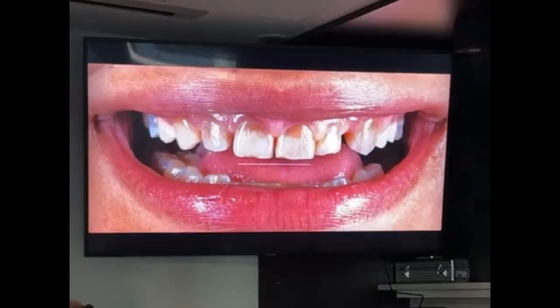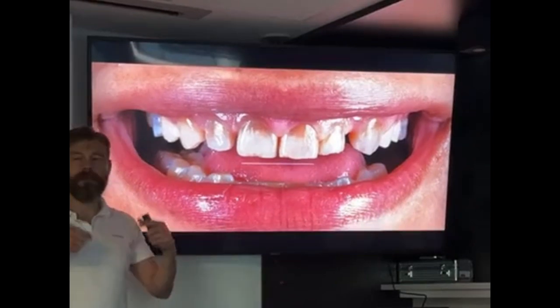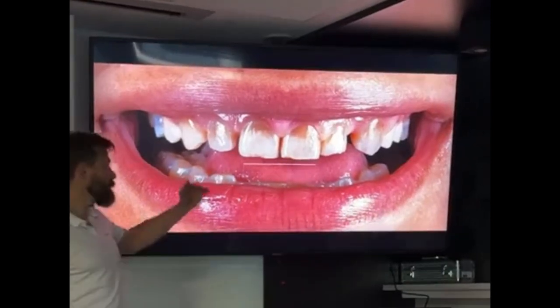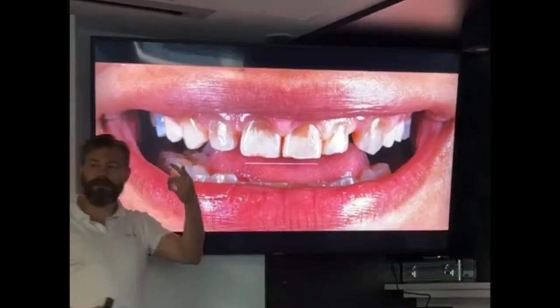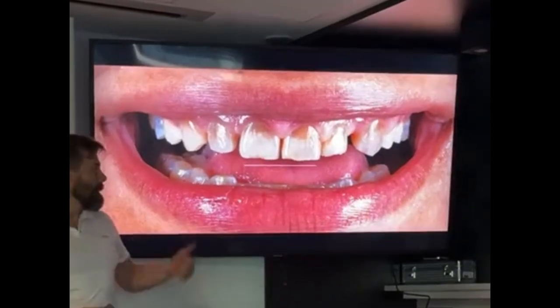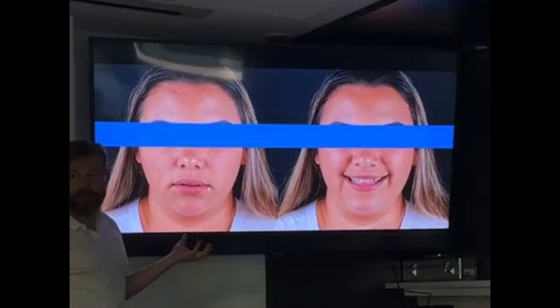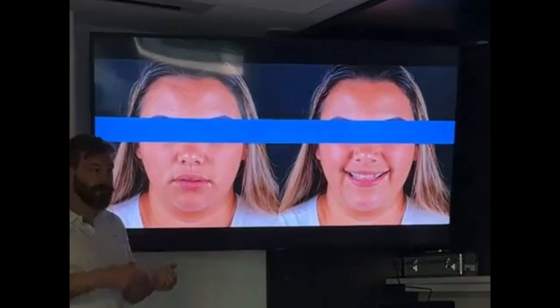You remember the treatment plan for our patients: when you're going to do a rehabilitation and the surgery, first I need to think where the aesthetic part of the patient is going to be, right? In this patient, you're going to redesign the incisal edge based on the aesthetic proportion of the patient, the lip at rest, and the functional part.